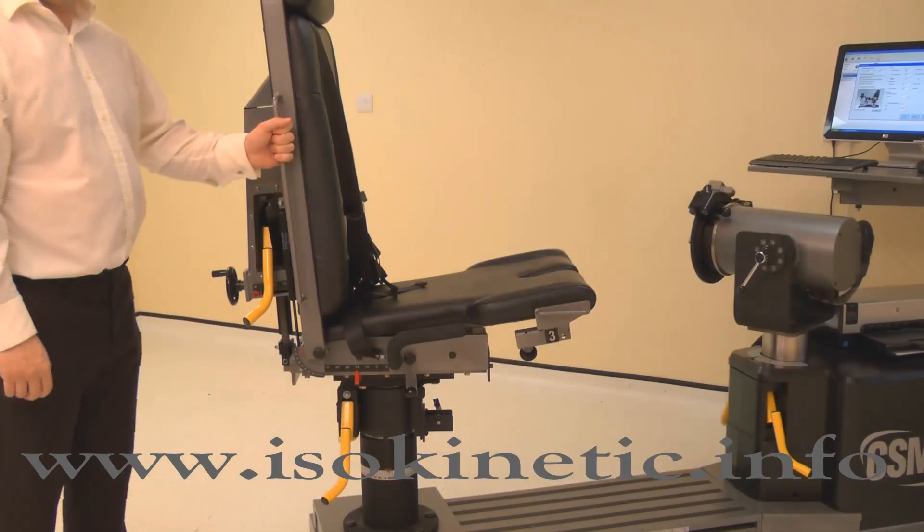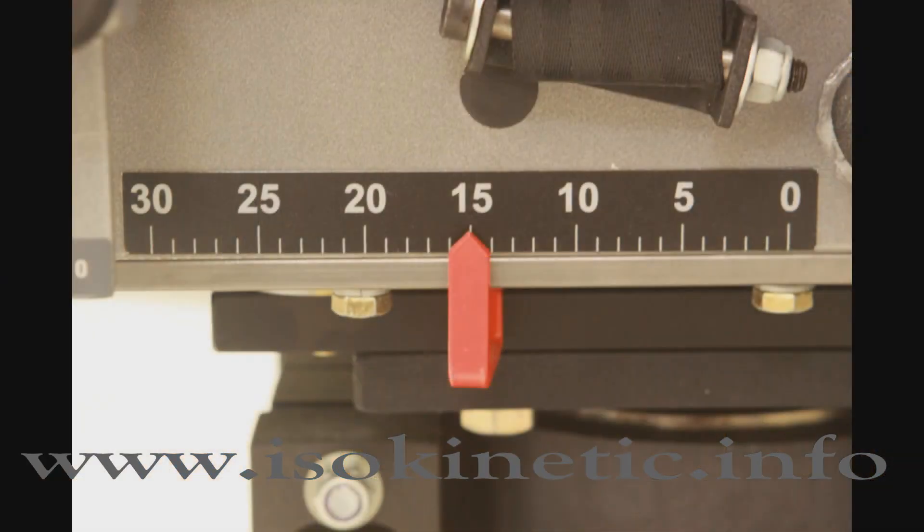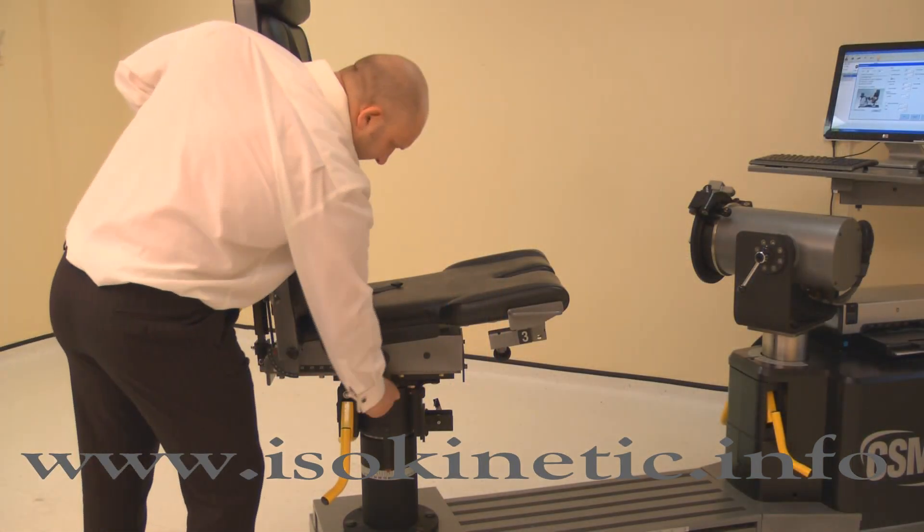The chair fore/aft is altered by raising either locking handle, then slide the chair bottom forwards or backwards. For the knee, adjust the chair fore/aft to position 15. Lower the locking handle to secure.